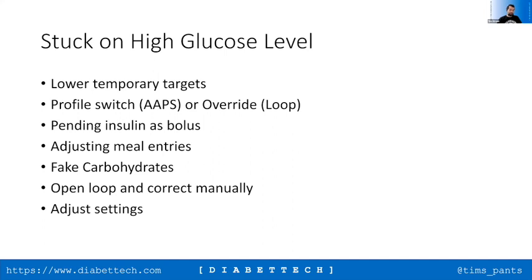We know people may be stuck on high glucose because they got their carb count wrong at a meal. So you might go back, think about what you had, review the packaging and go, oh, I got that wrong, and correct your meal entry.